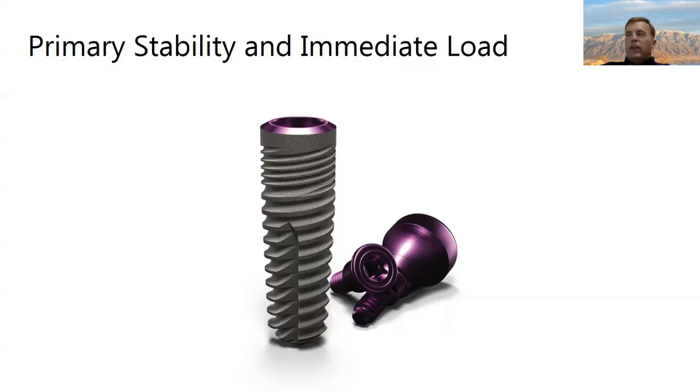Another thing that can be helpful is if you have 2 implants that are fairly close together in diameter, you might plan for the slightly smaller one and then have the slightly larger one as a backup. Don't neglect osseodensification. Sometimes, especially in the maxilla, if you do some densification, you can really give yourself a leg up in terms of your primary stability. Of course, there's one ideal implant for each site, but if you're a little bit concerned, it might not be a bad idea to have a little bit larger one on hand just in case.